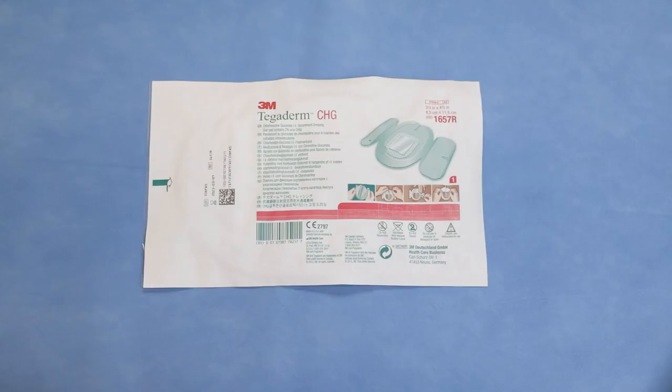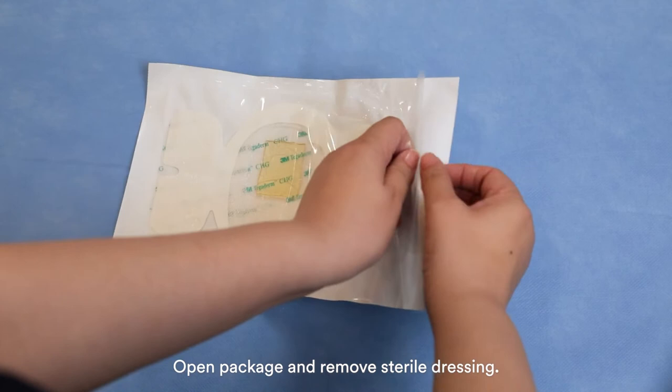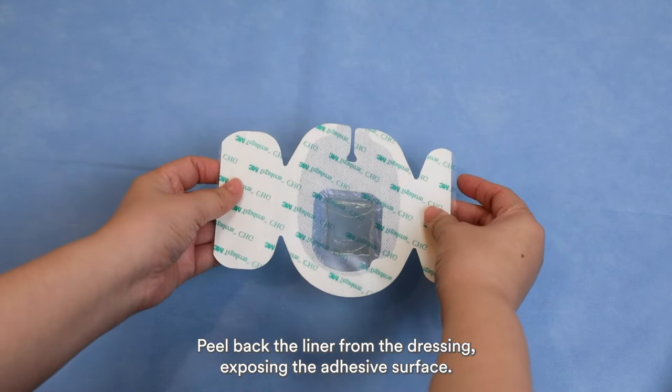Open the package and remove the sterile dressing. Handle the dressing by holding the sides. Do not touch any part of the dressing that sticks to the skin. Peel back the liner from the dressing, exposing the adhesive surface.